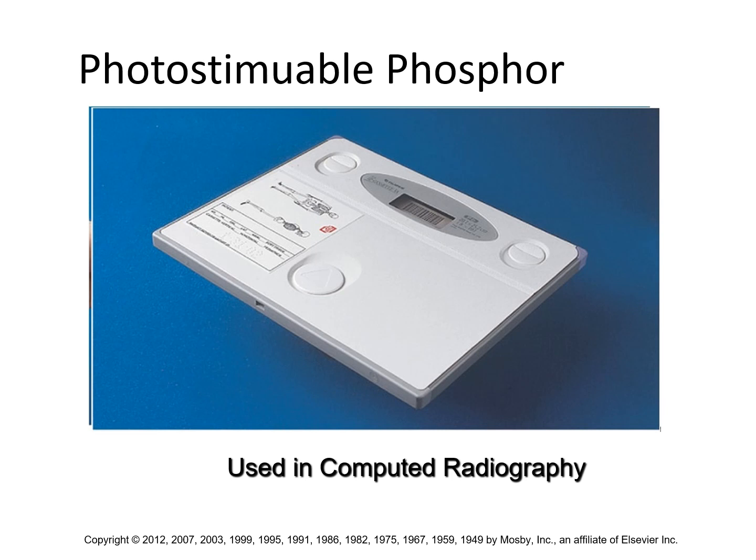So it's basically double the effort for each exposure on CR technology. The technologist has to go retrieve the cassette and process it, versus in DR technology, there is no retrieval of the detector. It starts downloading the data and processing it automatically without the tech having to do it. As soon as the exposure is over with, it's transmitting its data to the processing software on the computer.